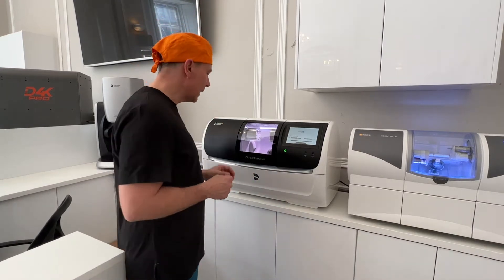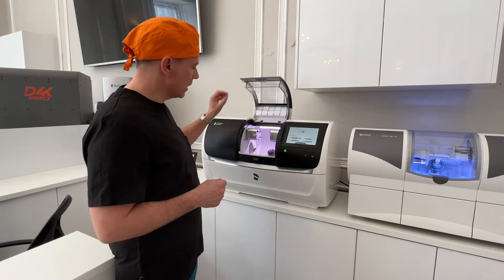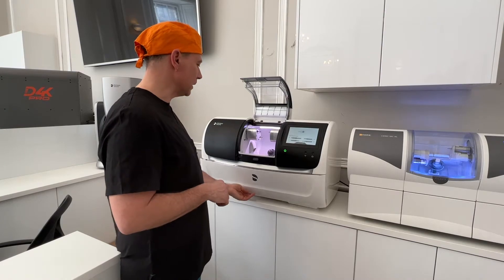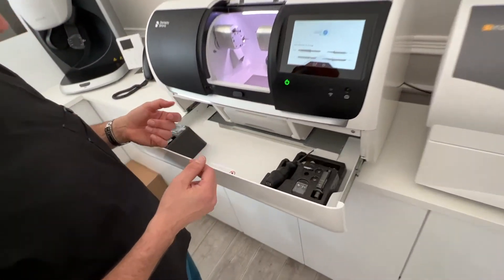If we start with the PrimeMill, it's very nice to see the solid door on here, and then of course we have our setup with the four motors, in the same way as the MCXL. When we move in here in the drawer we have quite a lot of compartments.